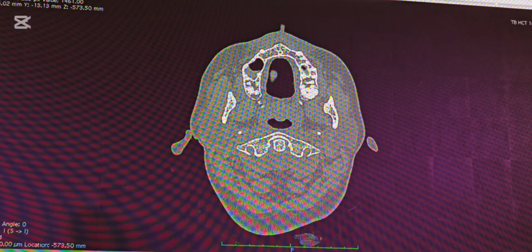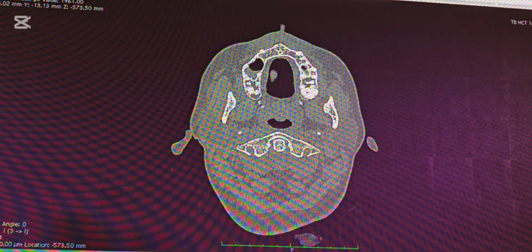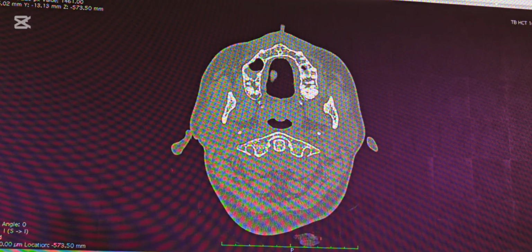Okay, so did anyone notice anything in the ear in this patient, the middle ear? Master? Did anyone? So always have a look when you are seeing CT/PNS, look for the temporal bone, and when you are seeing temporal bone, look for the paranasal sinus. See here.